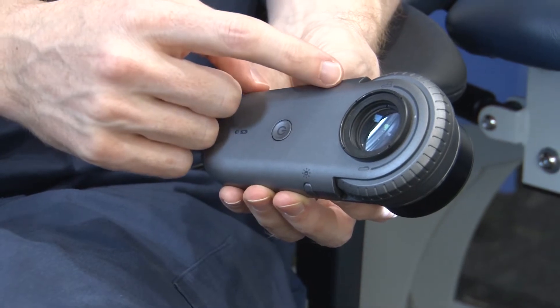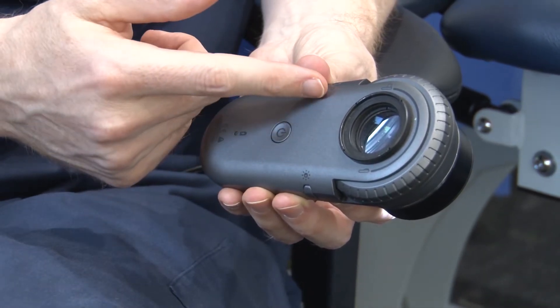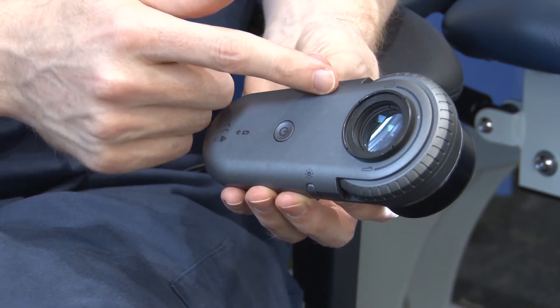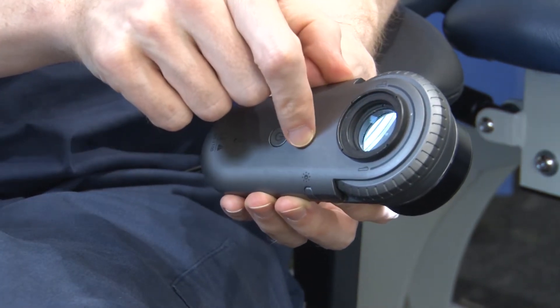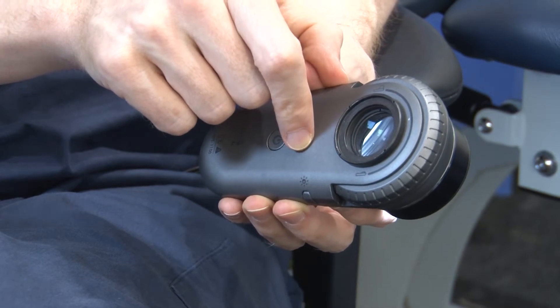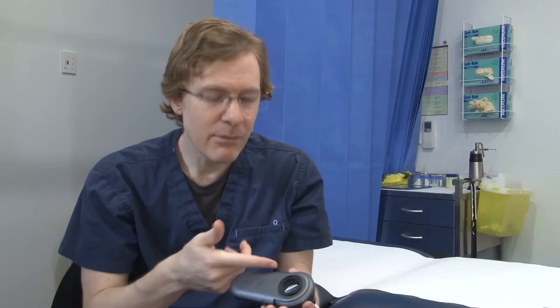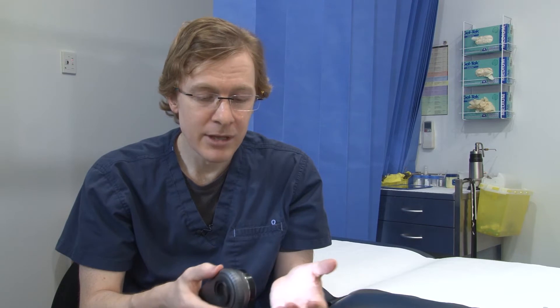The button on the left is the sort of feature you need in dermatoscopes these days, which is a polarising/non-polarising switch. You can see that the light looks different as you toggle the button on and off. If you're going to get a dermatoscope, get one with one of these. You've got to have polarising/non-polarising, or you're going to miss some lesions which only have polarising-specific white lines, for example.